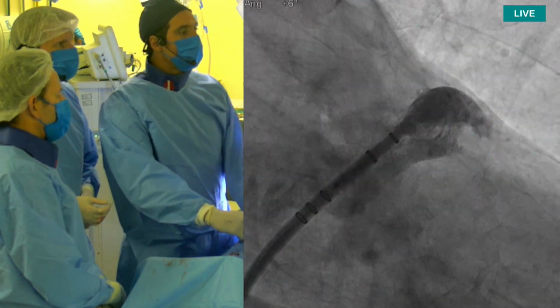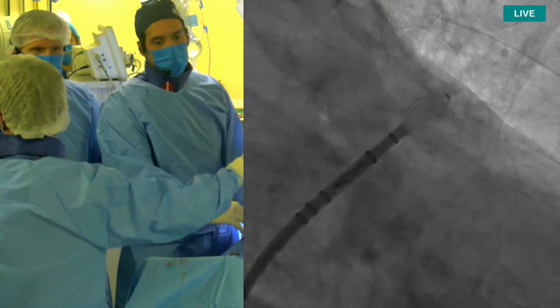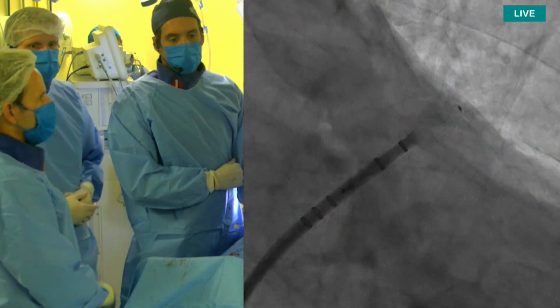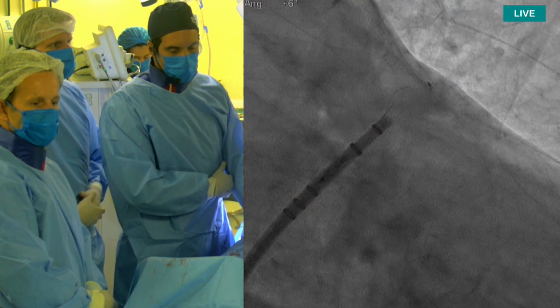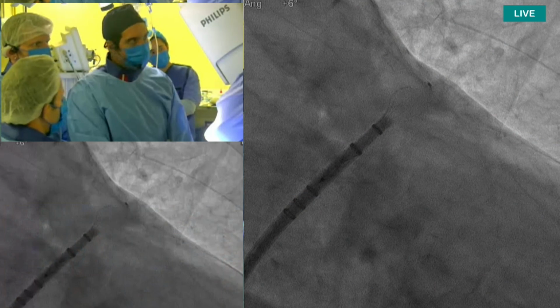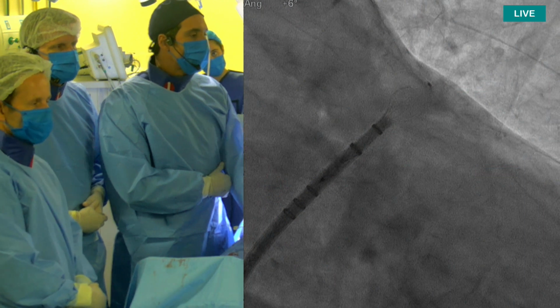Yeah, so can you see the echo images as well? Let's show echo as well. Echo and fluoro. Can I have both the images? We just have the fluoro for them. Felipe, echo, please. And Fábio, do you agree with what we can see from here, that you have plenty of space proximal to accommodate the device if you want to get to a shallower position? Do you agree?